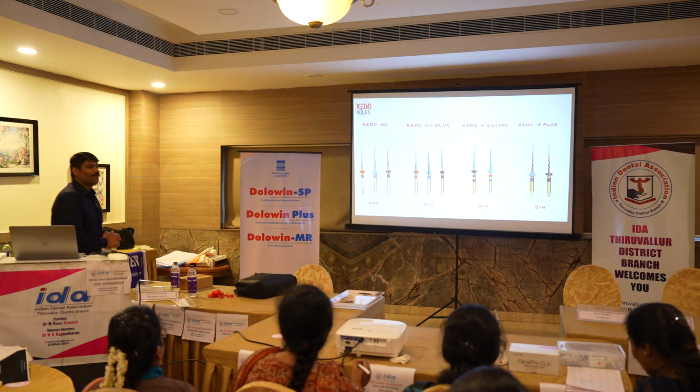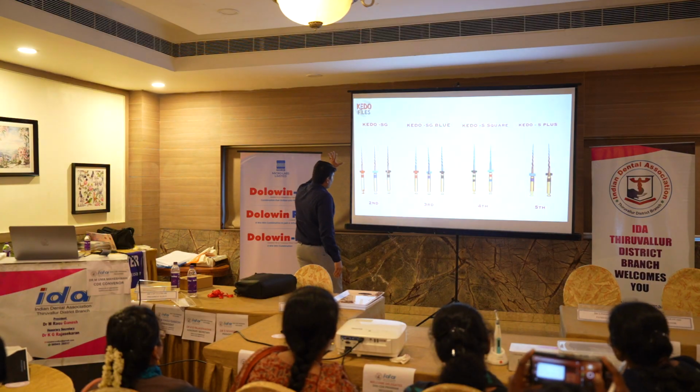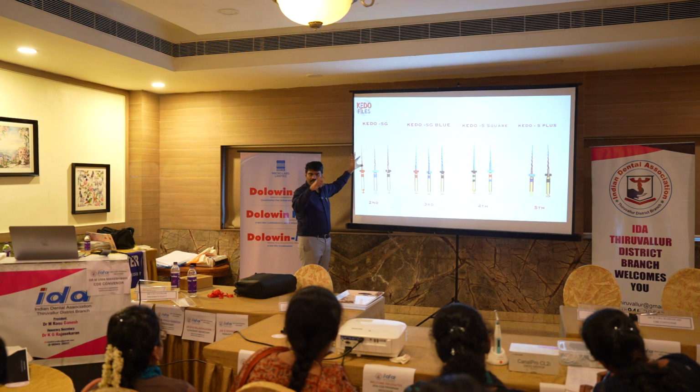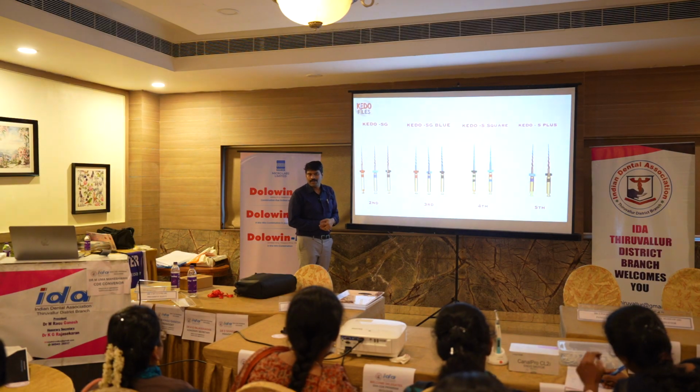You will have to tell me why generation-wise we developed. Now, same concept: in silver I bought, now it is in golden color. Silver is shape memory, gold, meaning this particular SG in golden color, has control memory. So fracture is less.